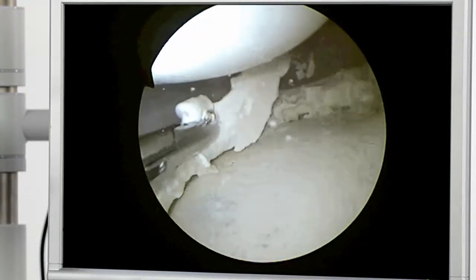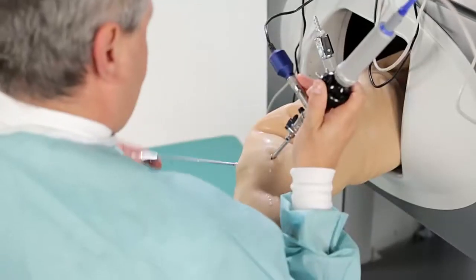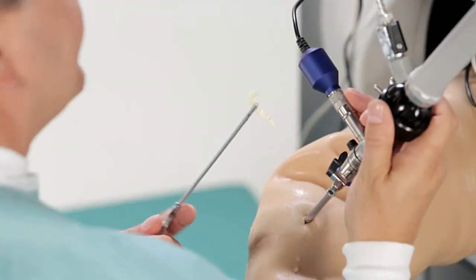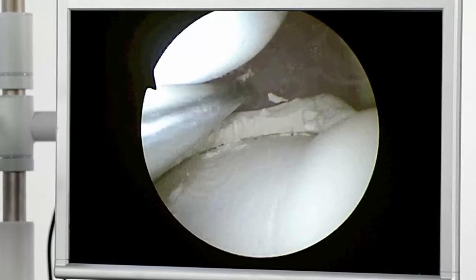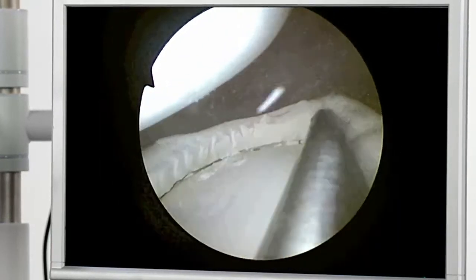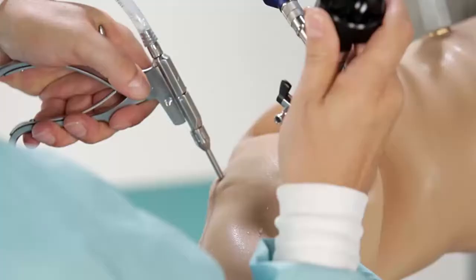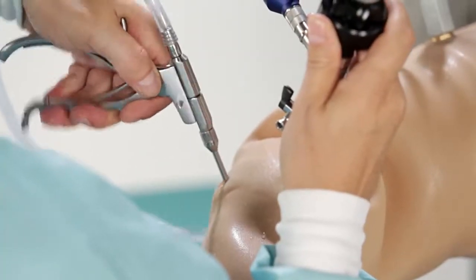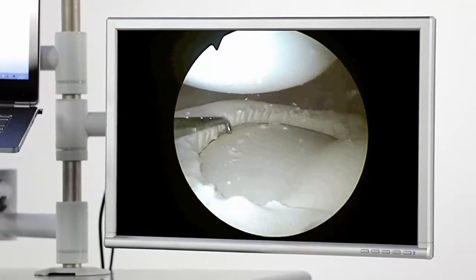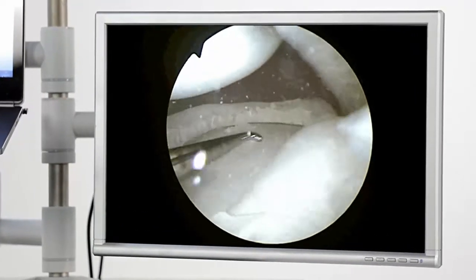The partial medial meniscus resection is completed on the posterior horn. Extraction of a large meniscus fragment is performed using grasping forceps, and the smaller remaining particles are removed with the suction punch.